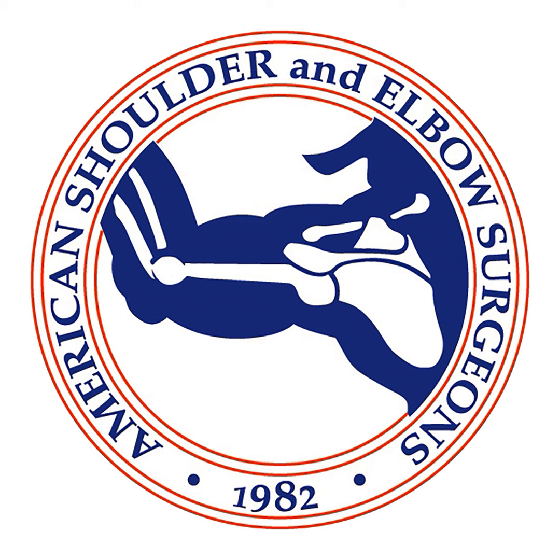So I think there's going to be less stress shielding seen. We're still early in the stemless experience, so we don't have any long-term data confirming that, but that's at least what we're seeing in the short term. I totally agree with Dr. Sperling that it is a faster surgery with less blood loss, and certainly the bone preservation is much greater.